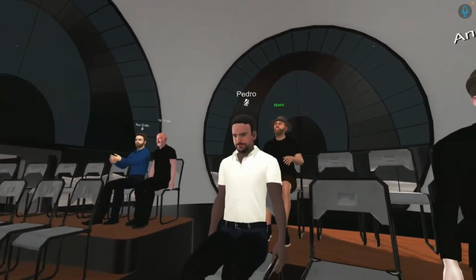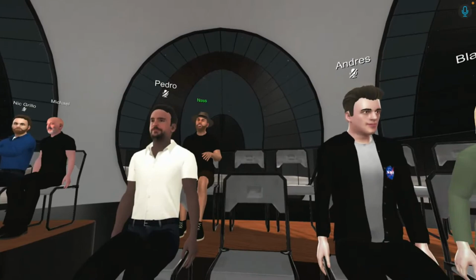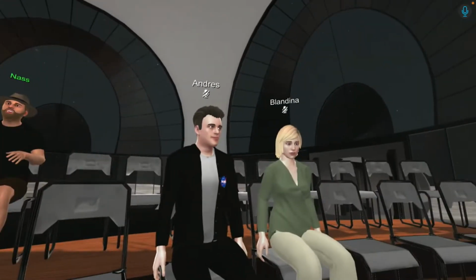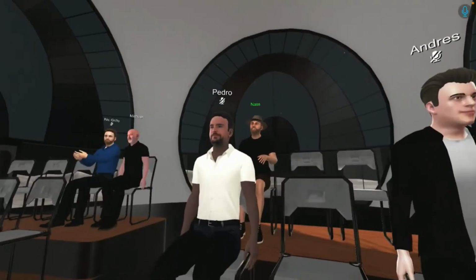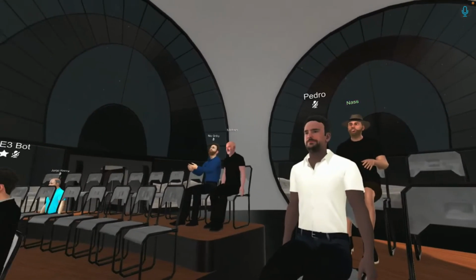Nas? So I totally agree that grayscaling the images will definitely give you a lot more contrast on vascular tissue and depth perception. Very good that Lukan brought up how we can evidence vascular leakage with intraop FA.